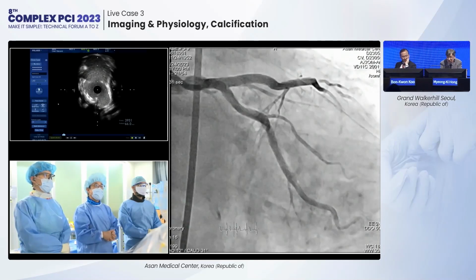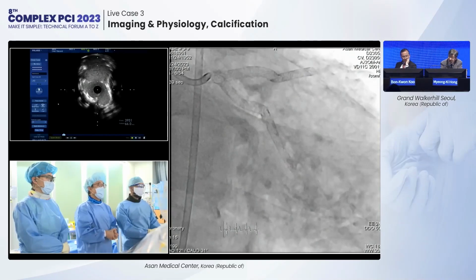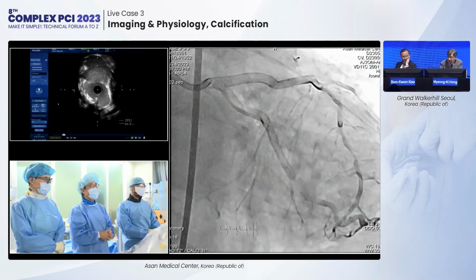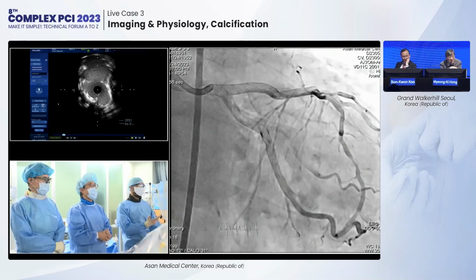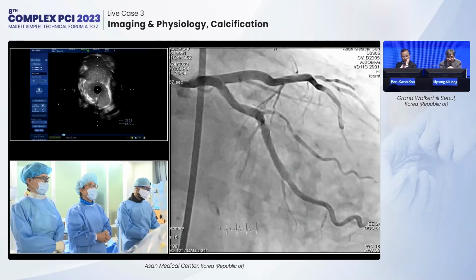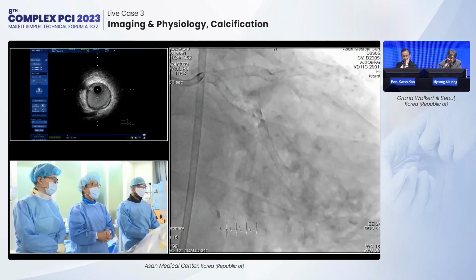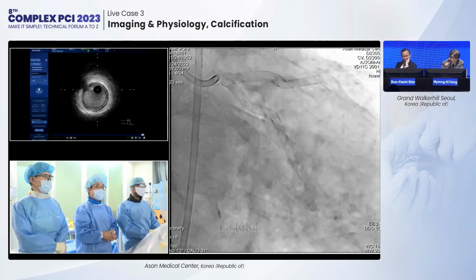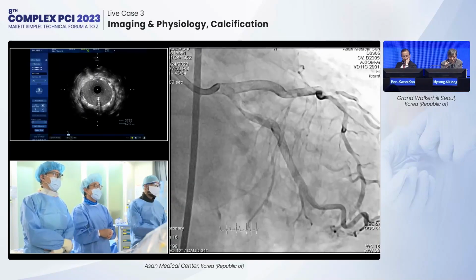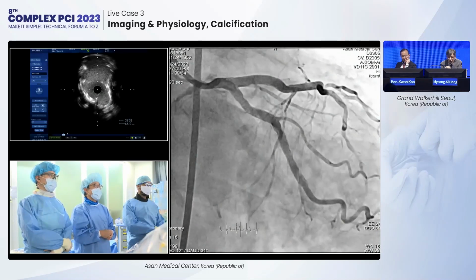And in the angiographic images, look at the ostium of the circ. There is some dense intensity compared to the other stent intensity. It means that some stent strut was on the downside of it. It means you did the correct crushing. And at the carina, there is a slight stent strut density in the carina portion. That must correspond to the IVUS finding. Overall, your whole procedure is a very, very excellent and educational case.